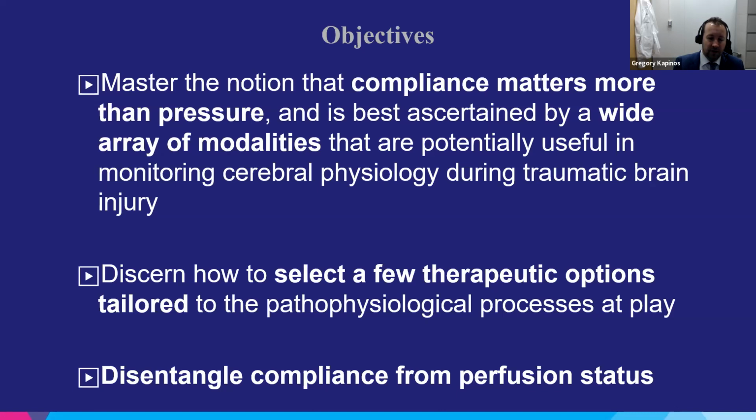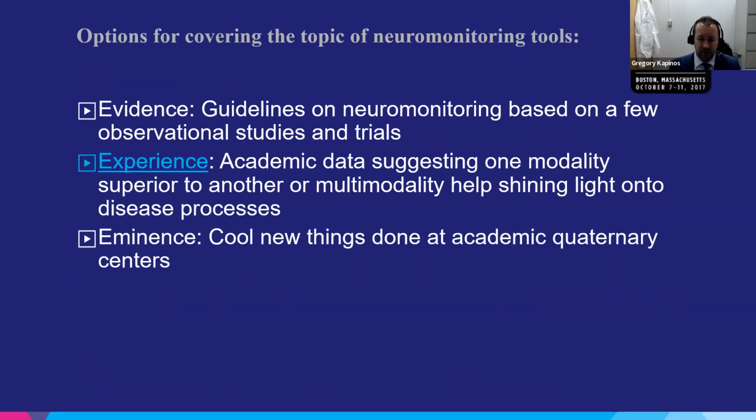And compared to the original publications that came from France in the early 2000s, I want to go further, and that's something that I proposed even 10 years ago, to disentangle the two issues of compliance from the perfusion status. And that's something that unfortunately was lumped together in the early publications talking about the use of TCDs in neurosurgery and neurotrauma.